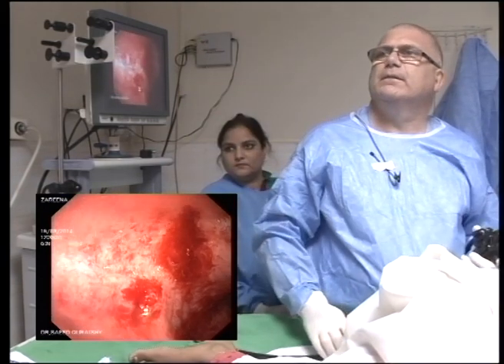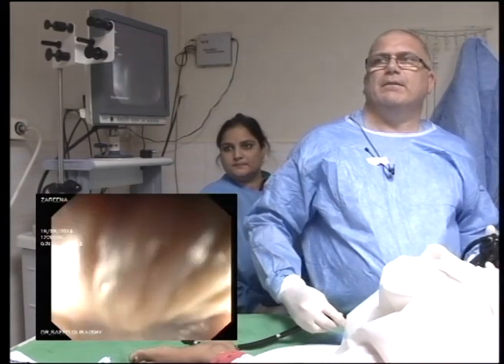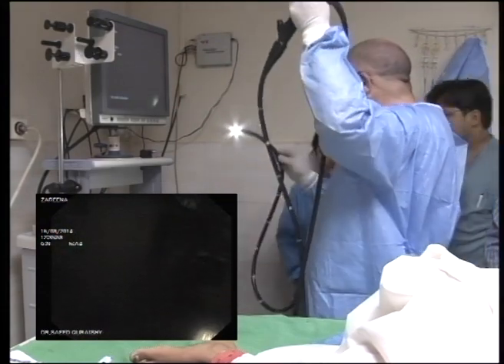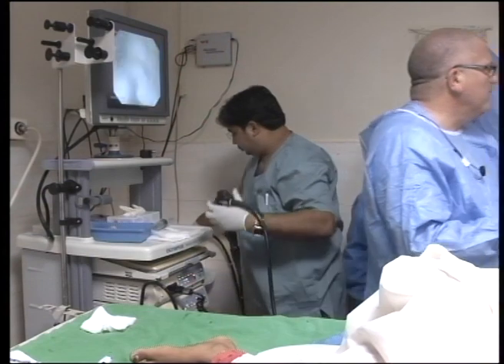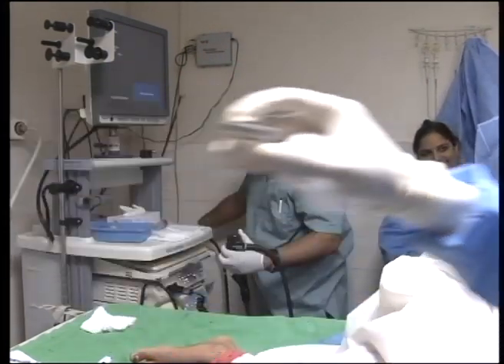I know you wanted to demonstrate the deep biopsies, but I think in this patient I wouldn't be terribly keen to do that because of the risk. And that's it. That was round to what's left of the cecum. How long was that?